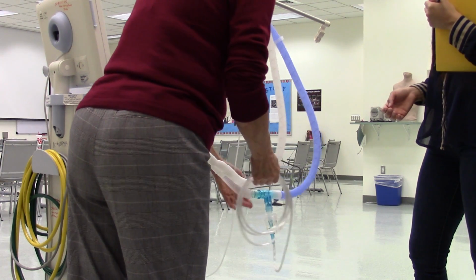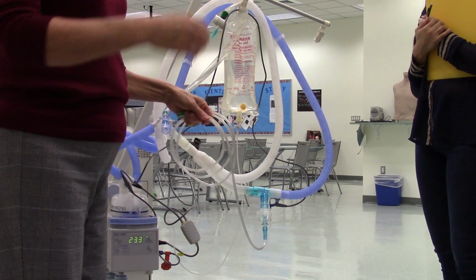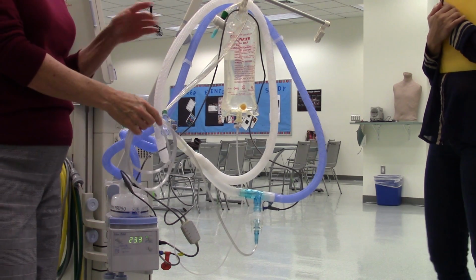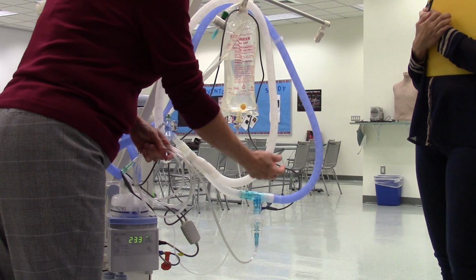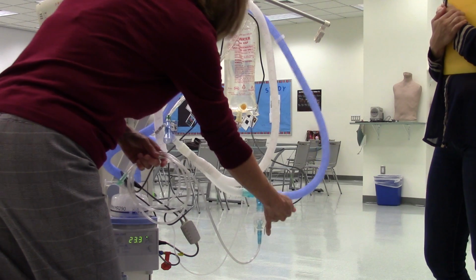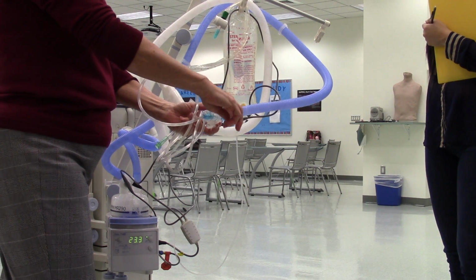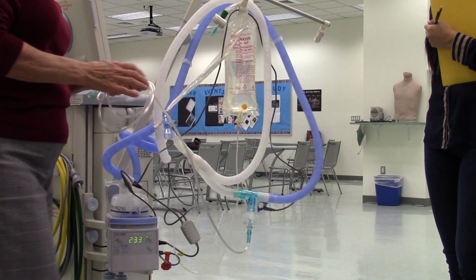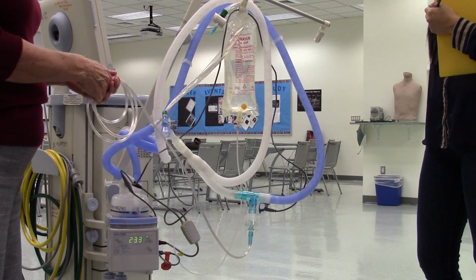Will having that on affect the temperature arriving at the patient? It does a little bit, so the nebulizer is programmed to wait a little while to see if it warms up. Even though your medication will be carried with the flow of gas, sometimes it still cools a little bit. But the humidifier knows that we're going to be doing things like that. I think it's programmed to not alarm right away. Okay.